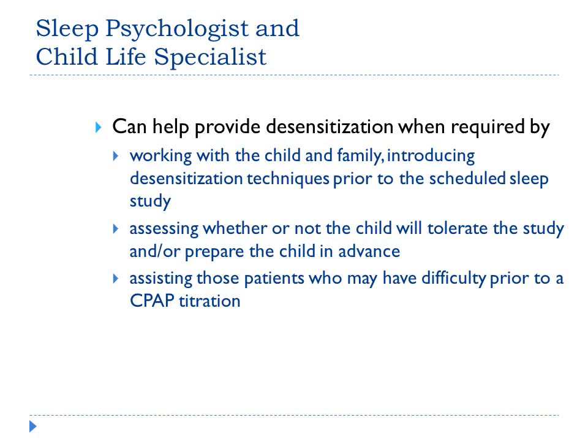They can assess whether or not the child will tolerate the sleep study. They can also help prepare the child in advance. And they are very good at assisting those patients who may have difficulty prior to a CPAP titration. So although our sleep techs are awesome and can do a lot of things, sometimes you just need to seek help from some of the child specialists to help with that.